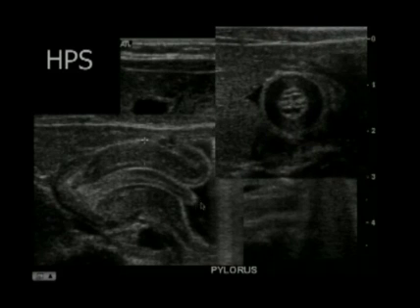And again, the transverse image shows marked muscle thickening. There are multiple channels through here. Again, hypertrophied mucosa getting compressed. This might be sort of the double track sign that you can read about with upper GI. Harris Cohen has written a lot about this particular sign.